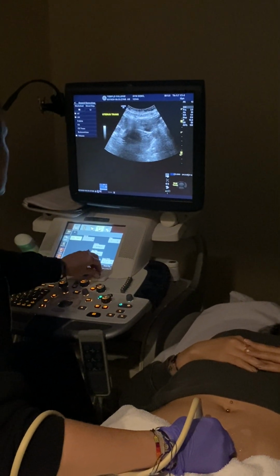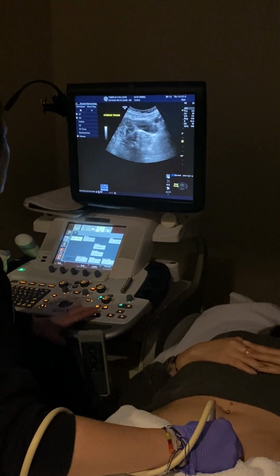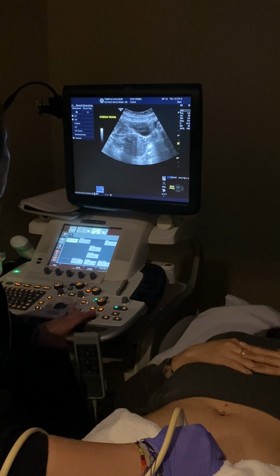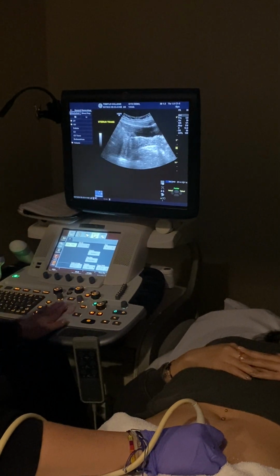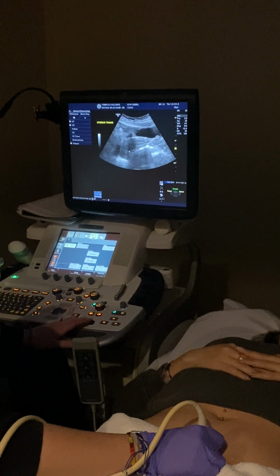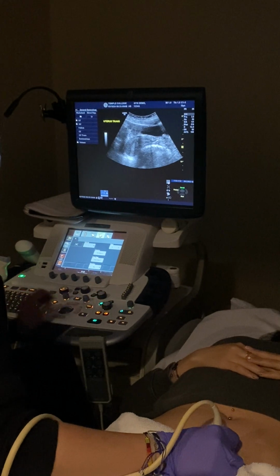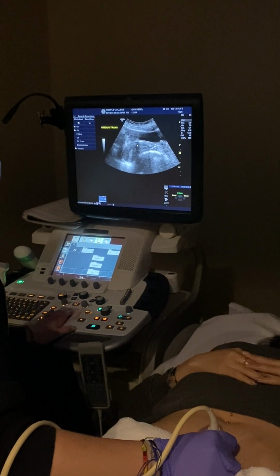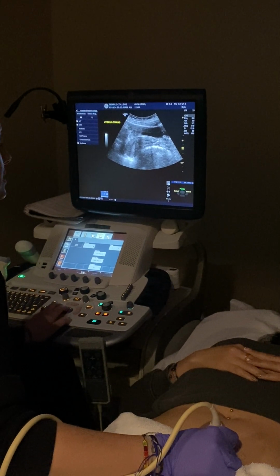Where's my focal zones? Are they not changing? Okay. So once again, cervix, and aim up, that's lower uterine segment. In long, this is the area that we're looking at. Right here, okay? So if this, come on gas, I'm trying to do something here. All right, so this is cervix, this is lower uterine segment, this is body where it's at its widest, and then fundus is here, okay?